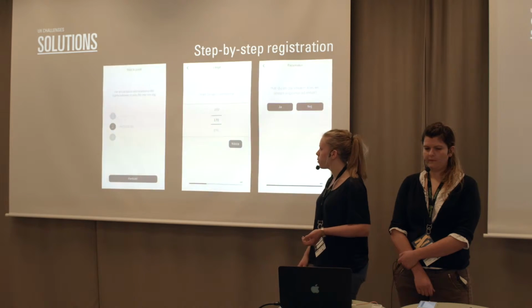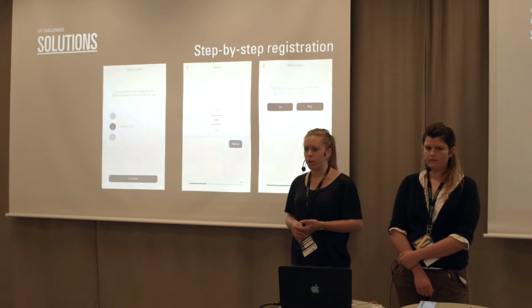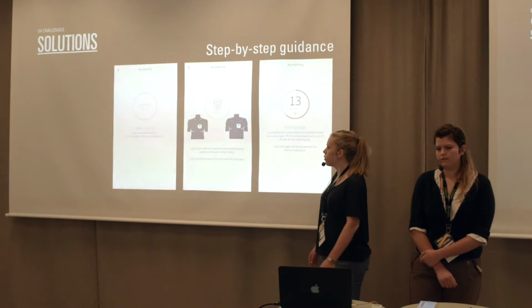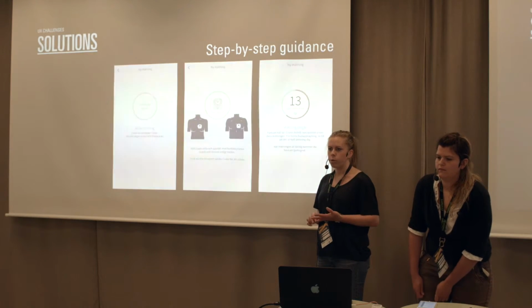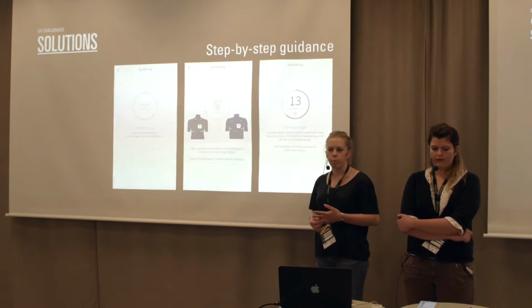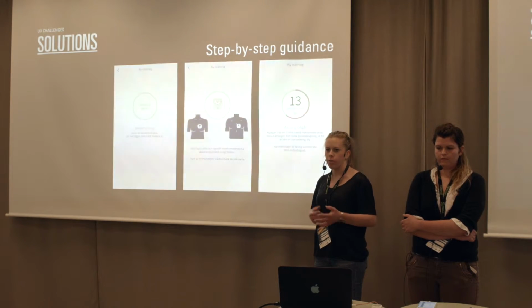I have seen some apps where you have a lot of forms and a lot of text fields, and it's just super boring. But here you have only one question and one button, usually. Also, you saw when we were doing a measurement, it's very step by step, and we tried to make the instructions as clear as possible to have as few misunderstandings as possible. So again, it's a lot of steps and a lot of clicks, but we think it's better for this type of user.